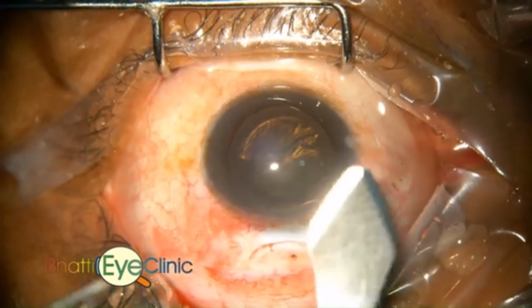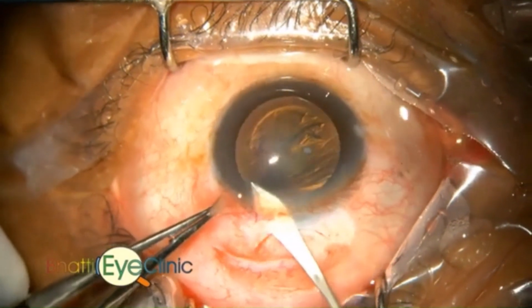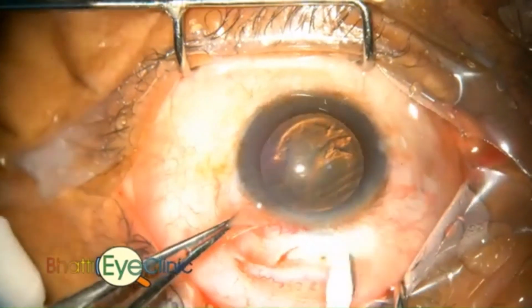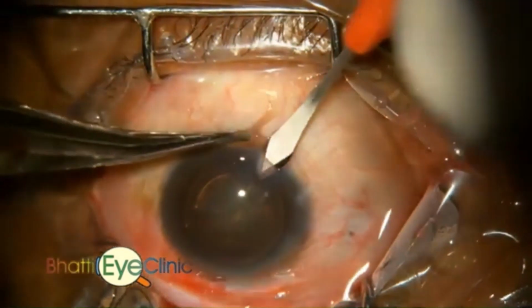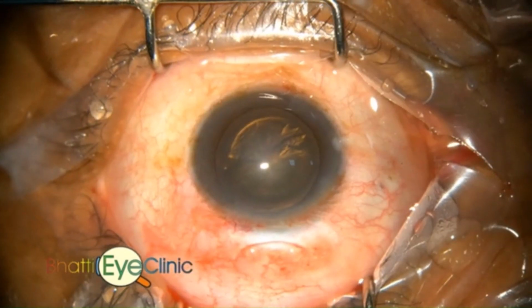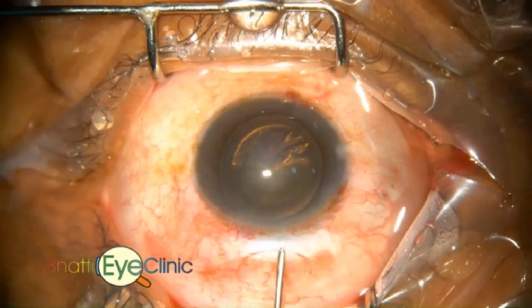The wound is enlarged because the IOL has to be inserted and the nucleus has to be delivered manually. The side ports were enlarged. Another side port is made for any manipulation with the help of a second instrument if needed.